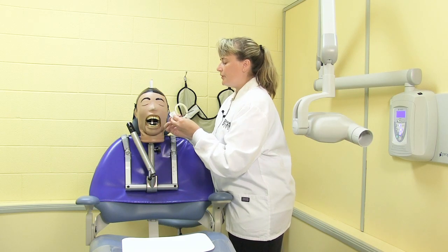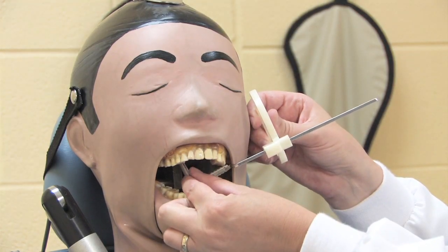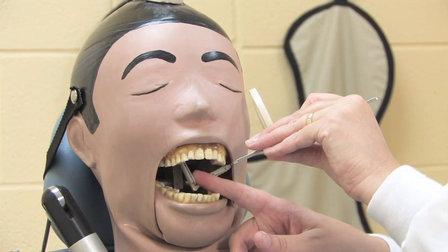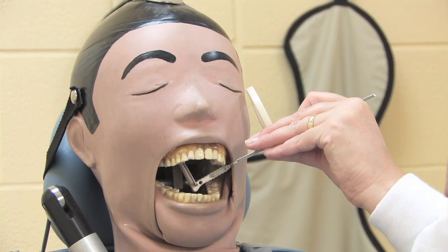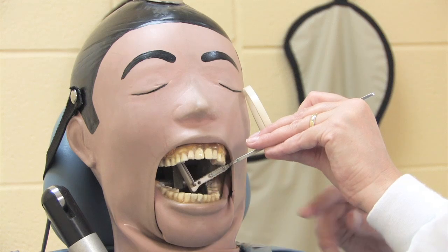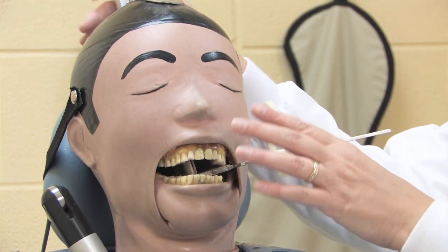For the molar view, again, the film is placed parallel to the long axis of the teeth, making sure that the film is on the lingual or behind the distal half of the second premolar. The block is up against the teeth that we're imaging, and the client closes.